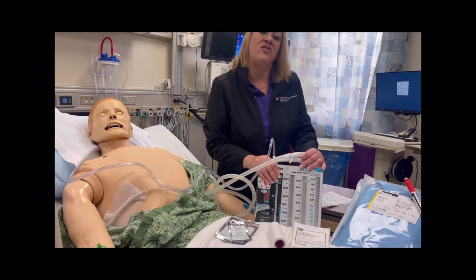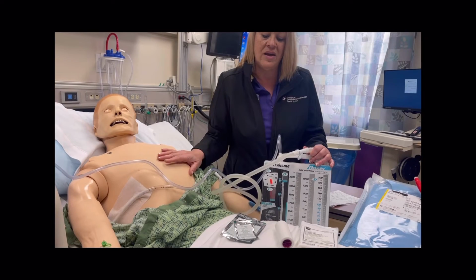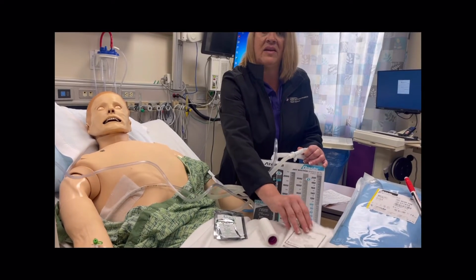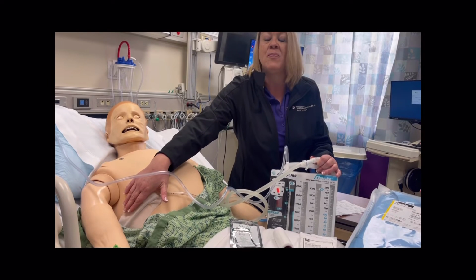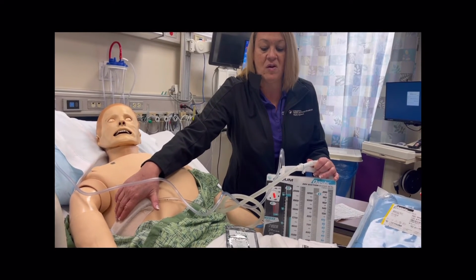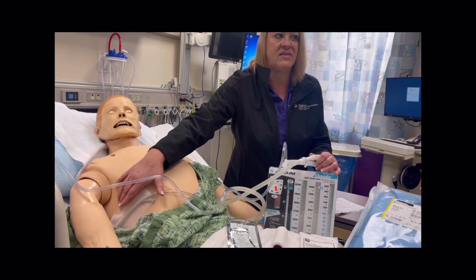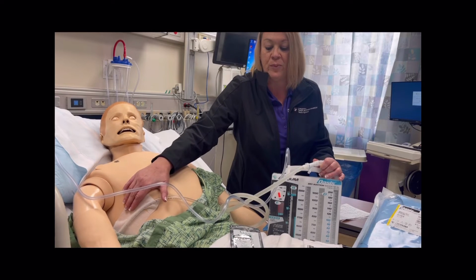When we go to discharge or discontinue a chest tube, the dressing again is the same. It's going to be a petrolatum dressing. It's going to be 4x4s, and it doesn't need to be 3-sided then, because this is the dressing that they'll go home with, and the provider has already determined that the need for the chest tube has been resolved. And then of course you're going to cover it with Mefix. Typically these are kept in place for 48 to 72 hours after the chest tube is removed.